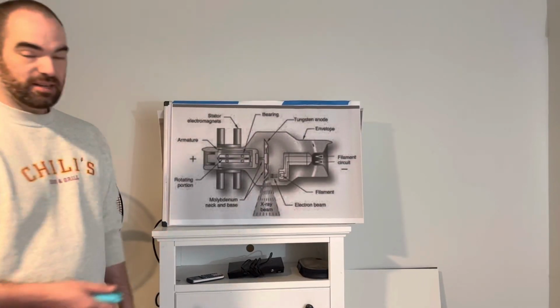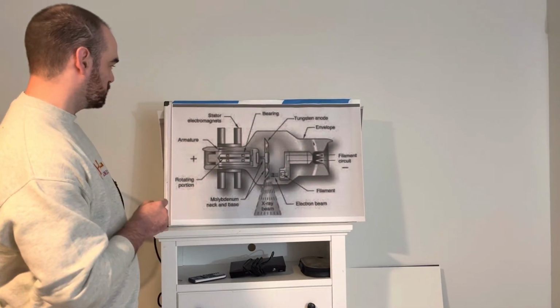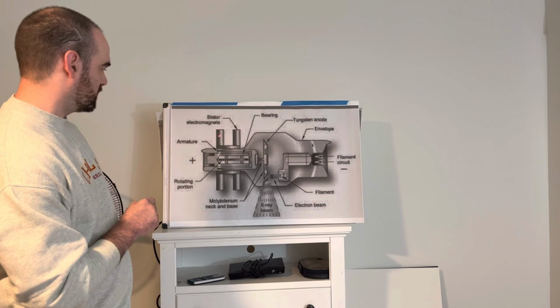So that concludes, oh, and the 6th point of induction, real quick, is at the stator electromagnets.